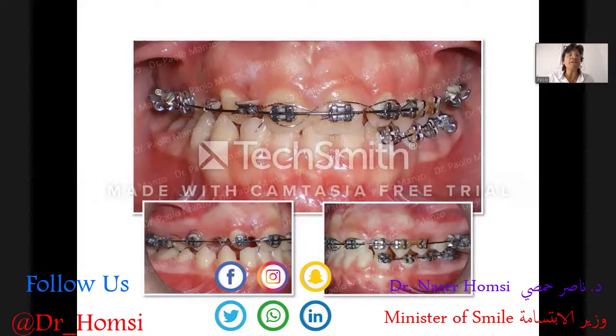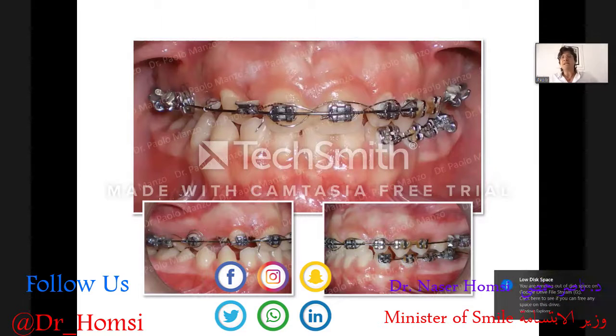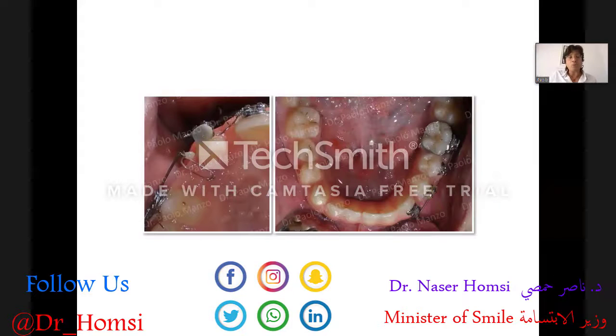Usually in this condition, even the patient can tell you, doctor, I don't like my therapy, I don't like my doctor. You never know if this is a result coming from a kind of disaffection, a relationship broken between the patient and the doctor. Sometimes the patient doesn't go anymore to the controls, doesn't follow the therapy very strictly. And this is the situation of the upper canine on the right. The canine was only ligated with the ligature to the wire, okay? And this was the situation.